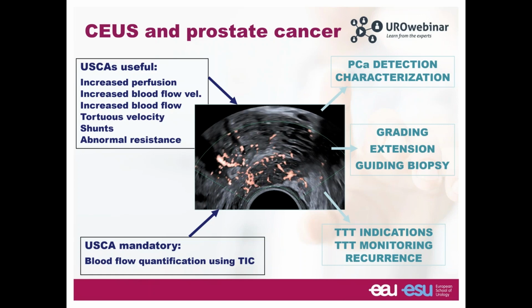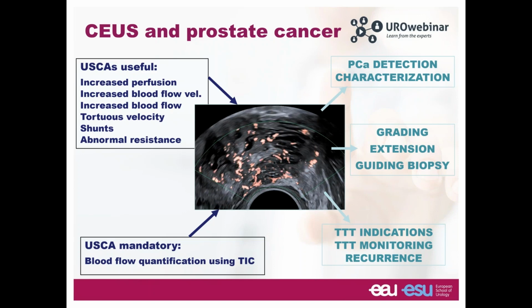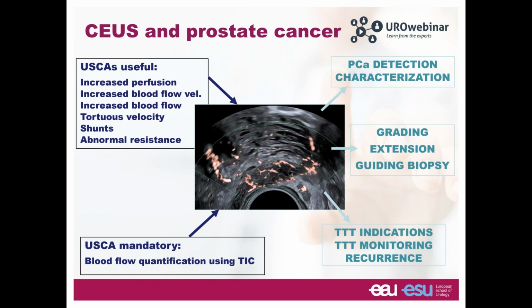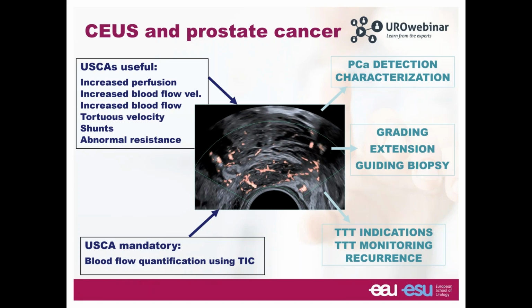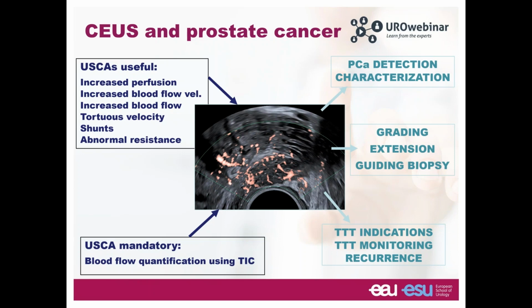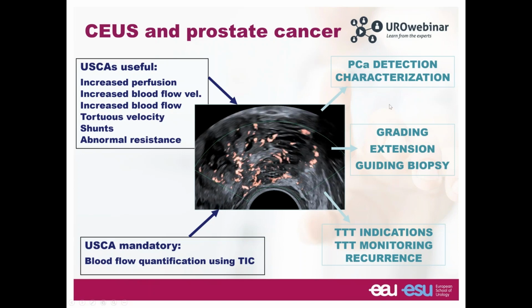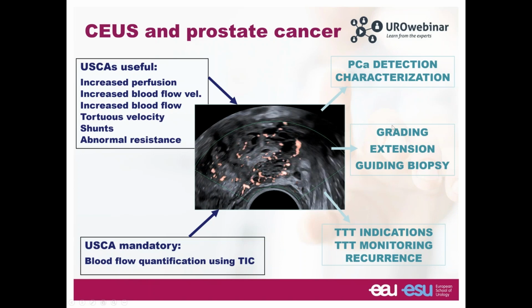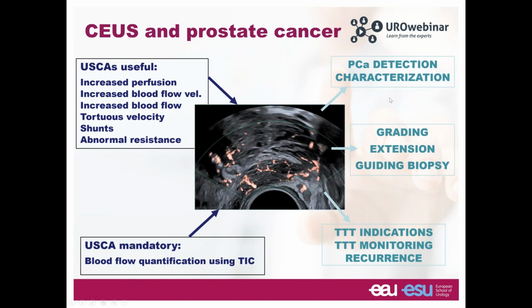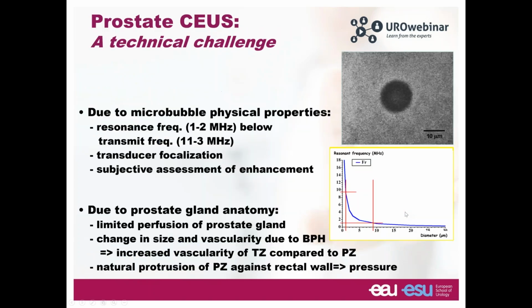But ultrasound contrast agents are also mandatory if we want to quantify the amount of blood flow inside the prostate or inside lesions. And this is something that has been done. It's probably a very exciting approach. Prostate cancer detection can be improved or characterized using that approach. We can also grade the prostate cancer, guide the biopsy, and follow the patient.